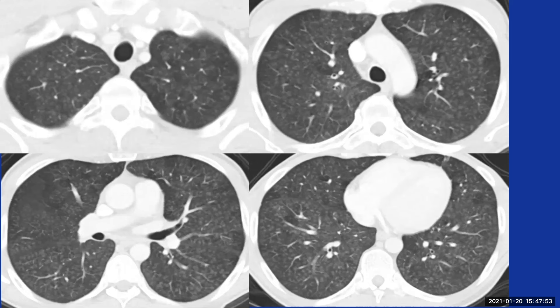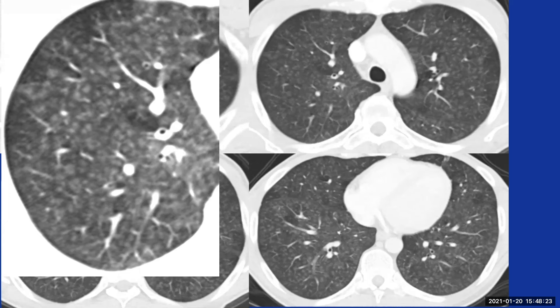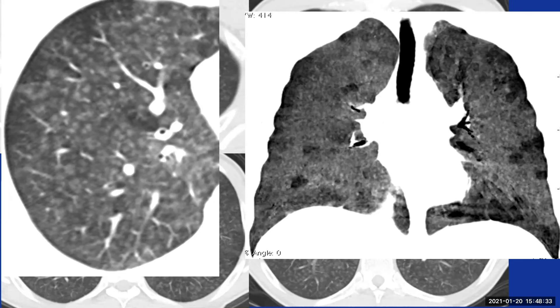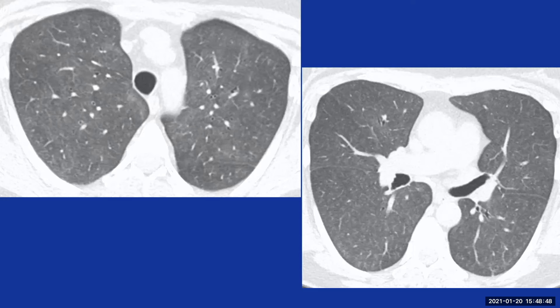Another example really shows a nice example of centrilobular nodularity bilaterally. We know they are centrilobular because they demonstrate relative subpleural sparing — by definition, centrilobular nodularity should give subpleural sparing based on secondary pulmonary lobular anatomy. There are superimposed areas of mosaic attenuation bilaterally, likely representing air trapping. The minimum intensity projection image brings out the secondary pulmonary lobular anatomy and areas of mosaic attenuation confirmed as air trapping in this patient with non-fibrotic HP.